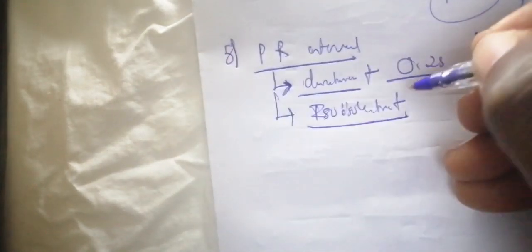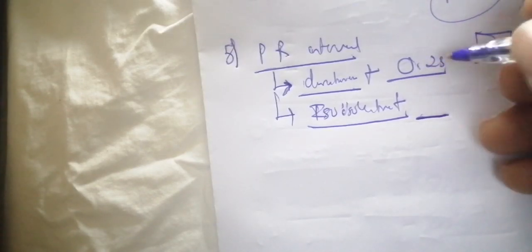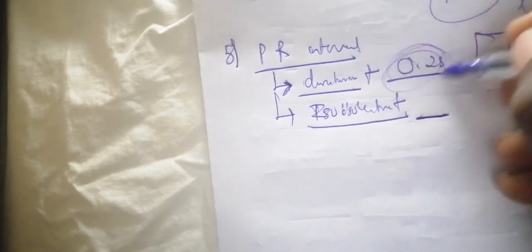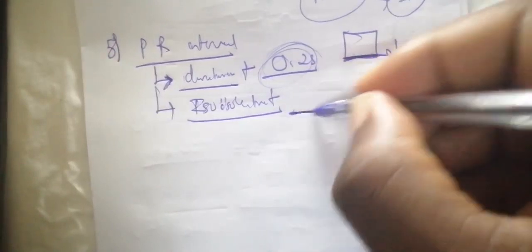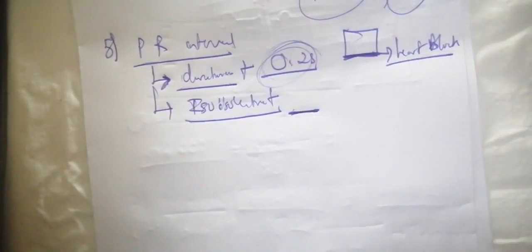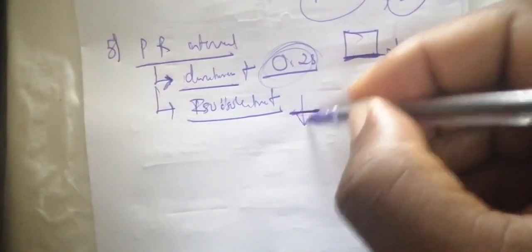And we have also the isoelectricness. Is it clear? Particularly if you have a depression of the PR interval, it corresponds to pathologies. In the case of the delay or lengthening of the PR interval, the diseases that we have there are heart blocks. Is it clear? Particularly the nodal blocks. Heart blocks.